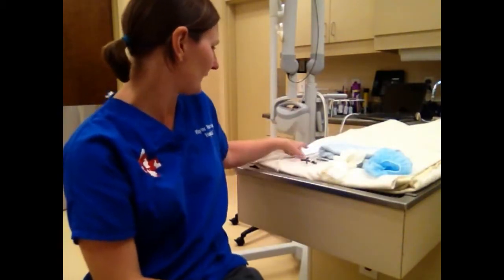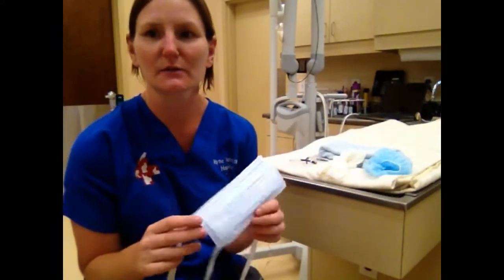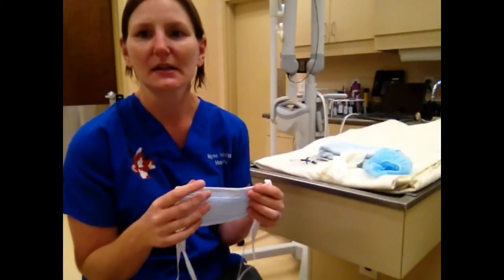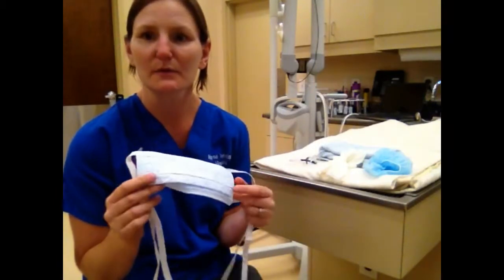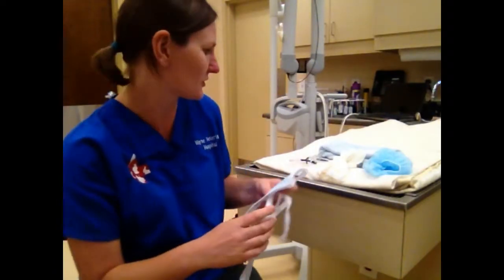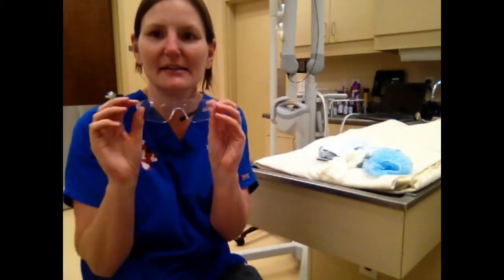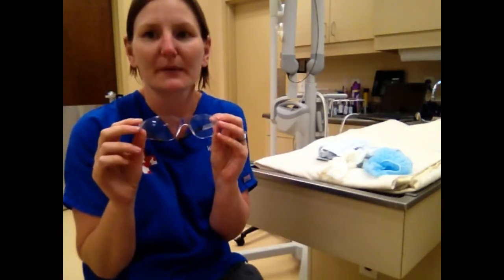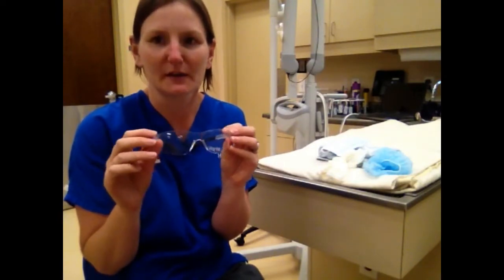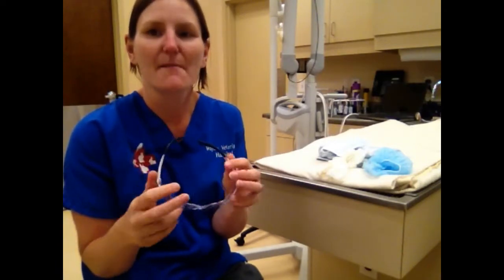I have a surgical mask. Again, when we do the dental, obviously the dog's mouth has a lot of bacteria. We're using water, and this can help the bacteria aerosolize, so we want to make sure we don't inhale that and cause ourselves any infections or problems. And then finally, I have my safety glasses. Again, this is to prevent any bacteria from getting into my eyes, and also there is some risk of calculus that we chip off coming flying out, and we just want to protect our eyes from any damage.